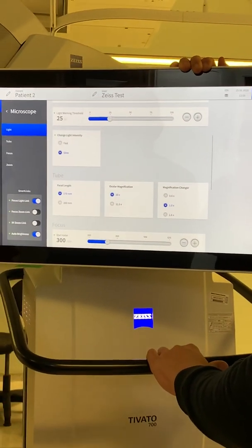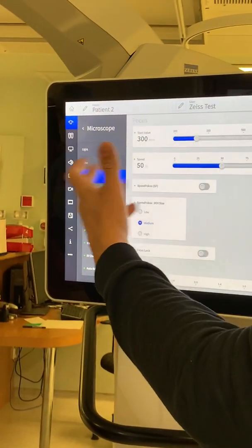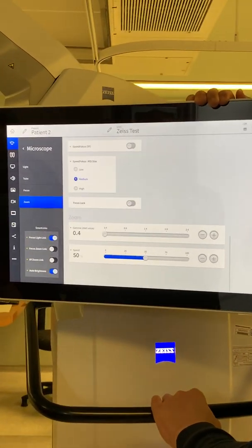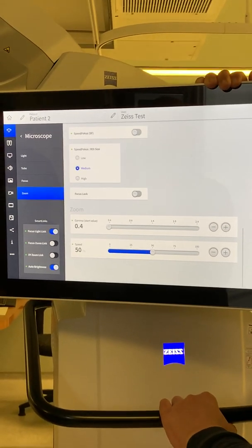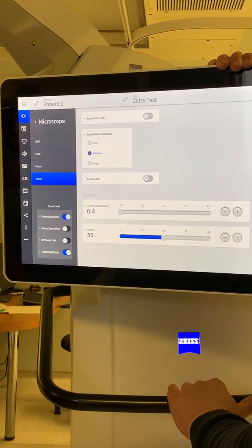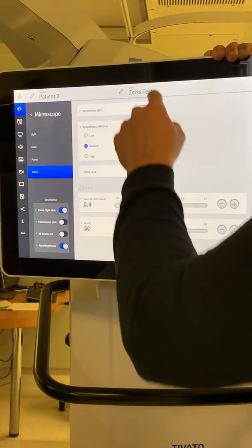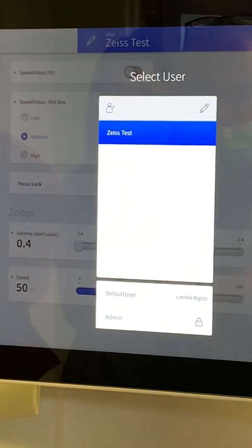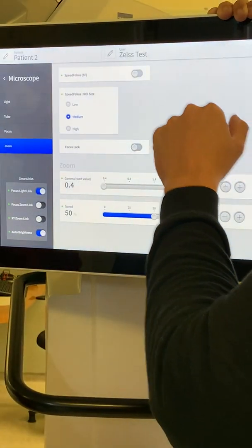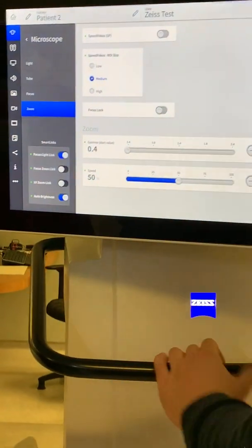Those other settings are the geeky start-up settings — don't touch them; there'd be no reason to. They don't reset themselves, so you have to know what you're doing. If you need to reset, start a new profile: click on the name and press Add, then enter whatever profile name you want. To delete a profile, go to the pencil icon, highlight it, and press Delete. Note you can't delete the active user — you'd need to switch to another user first.